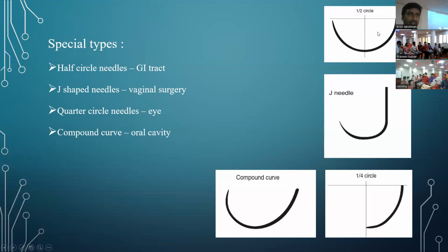So if you're not going very deep, you need a 1/3 circle or half circle. Look at the first image versus the third image.